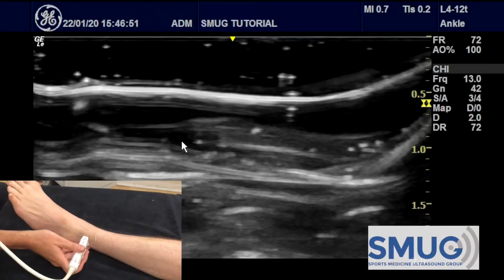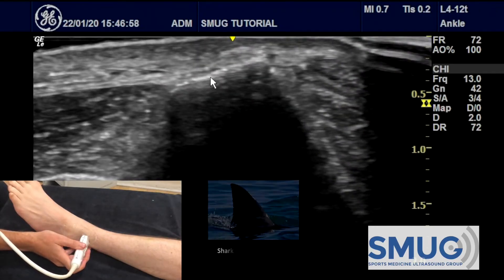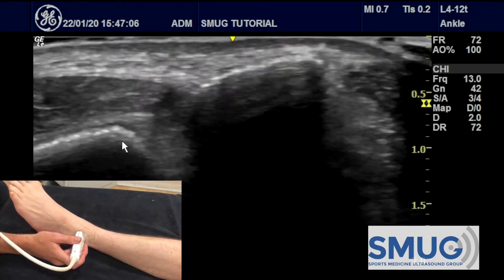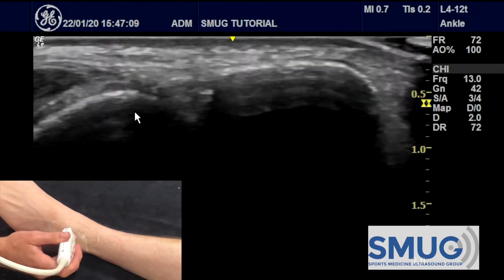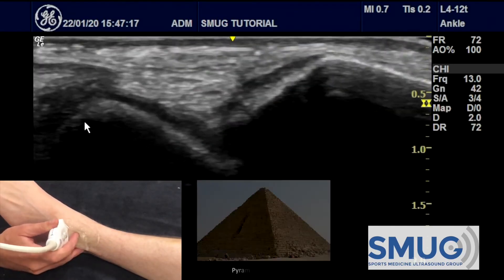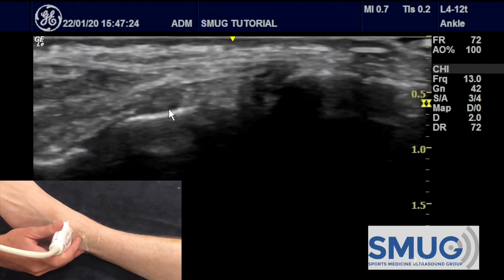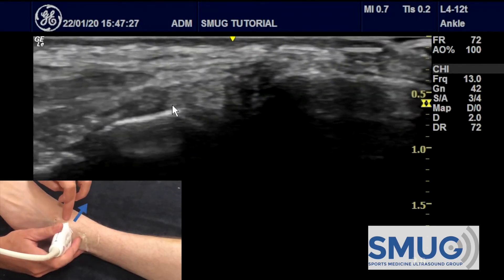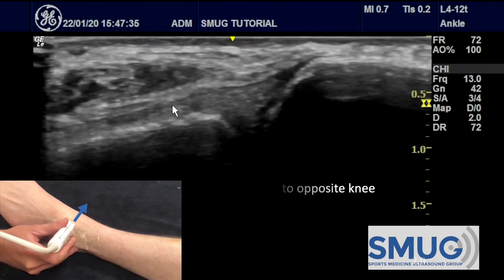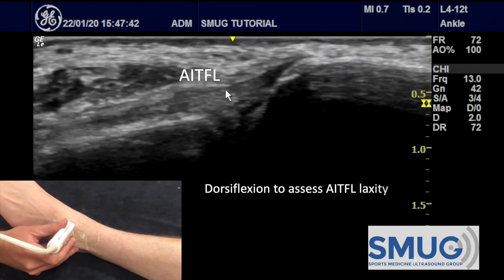To scan the lateral ankle we first start at the fibula, which has the shape of a shark's fin on screen. Moving down distally you see the tibia and fibula coming close together. As we slide off the distal end of the tibia we start to see the lateral talus — you know it's the talus because it's got articular cartilage and is in the shape of a pyramid. We then move back up proximally and fishtail this end of the probe up towards the opposite knee, and you can see the AITFL nicely going between the two bones.